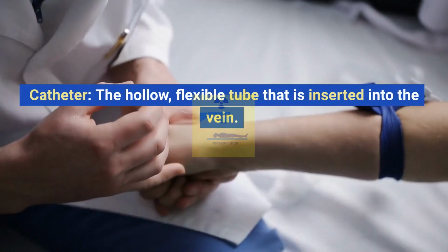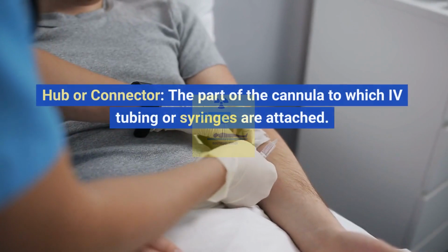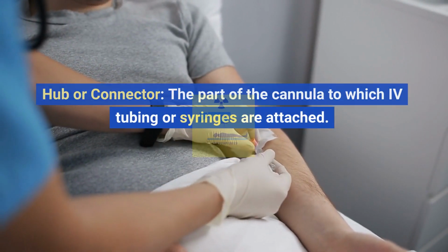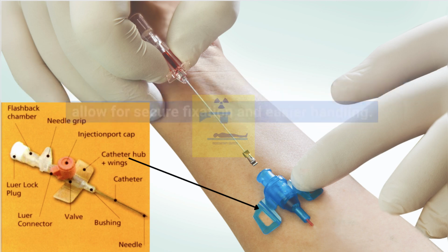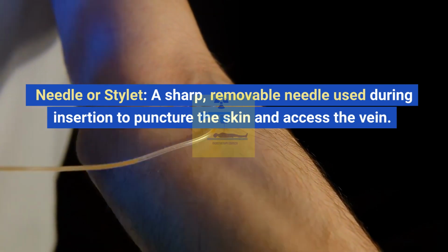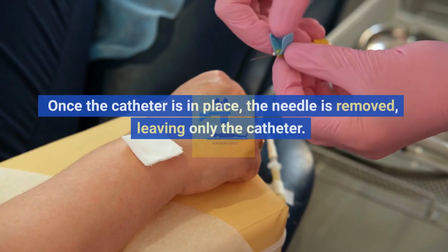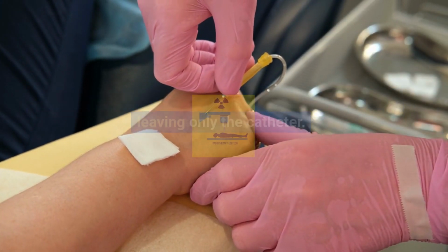Catheter: the hollow, flexible tube that is inserted into the vein. Hub or connector: the part of the cannula to which IV tubing or syringes are attached. Wings: small, flat extensions on either side of the hub that allow for secure fixation and easier handling. Needle or stylet: a sharp, removable needle used during insertion to puncture the skin and access the vein. Once the catheter is in place, the needle is removed, leaving only the catheter.